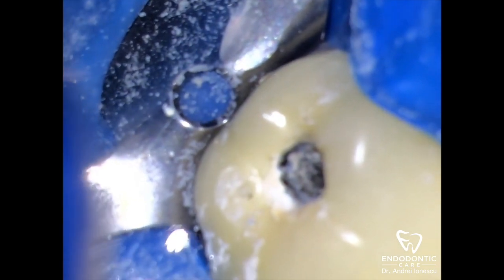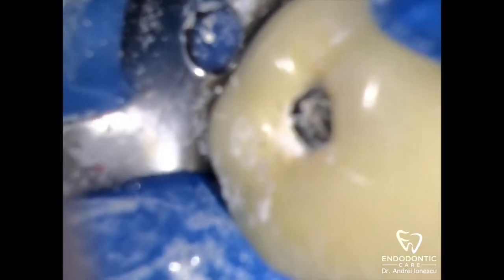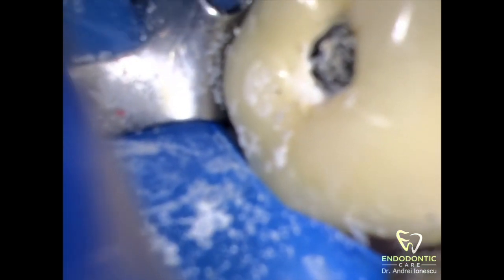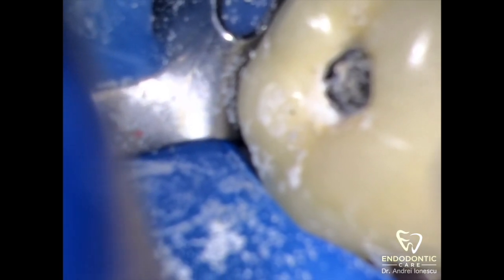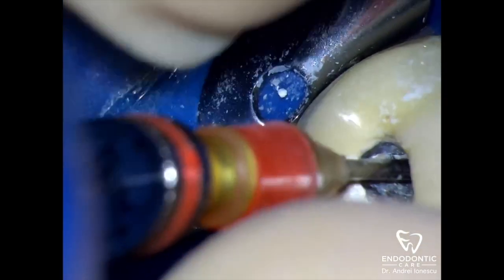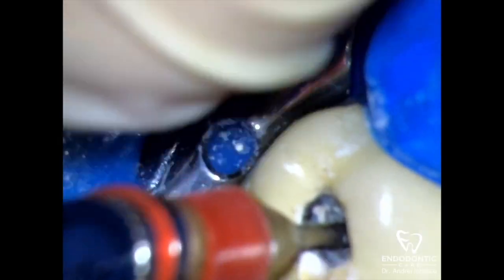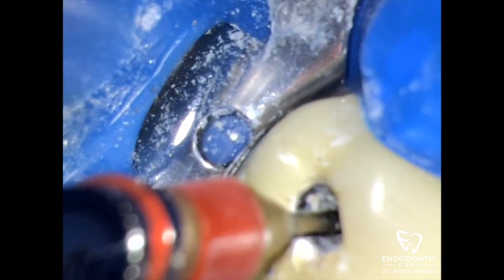Now, when we're ready, we're going to place the corresponding instrument assembly over the top of the exposed instrument, and we're going to be turning the screw wedge in a counter-clockwise direction. We're going to rotate it until we feel it engaging the file, so it becomes securely locked in place. Then as we continue to turn in a counter-clockwise direction, you pull up on the file and hopefully it comes out of the canal.